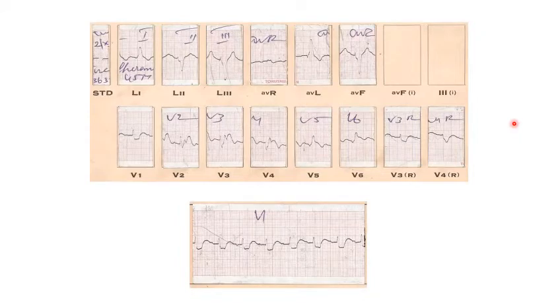Yeah. Do you think it is a P wave? Sir, it's looking more like an IV conduction defect type of thing. What conduction defect? Intraventricular. If you have a doubt, see, you are seeing something here. See, there is some notch here. So if you feel there is a notch here, if you want to make out whether it's a P or not, what will you do? You should measure the distance from here to here and here to here. So it has to be the same. If it is the same, then you should think that it is a P wave.